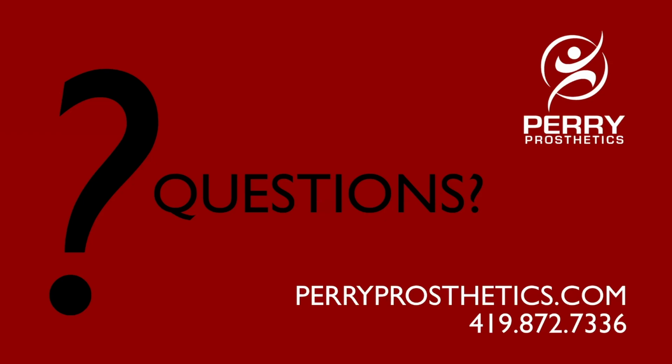So we have asked one. Yes. Can you read that, or you want me to read it to you, bud? Well, they asked, just to be clear, if we start with a clear plastic test socket right after the incision heals. No, once the incision heals, we want to put them in a stronger compression for at least 10 to 14 days to help shape that limb. Then we cast them or scan them. We do a digital scan or a cast, and then utilize that model to build the first test socket.